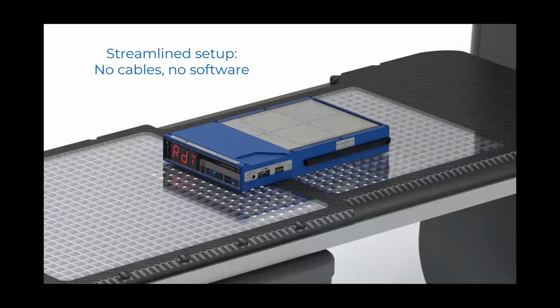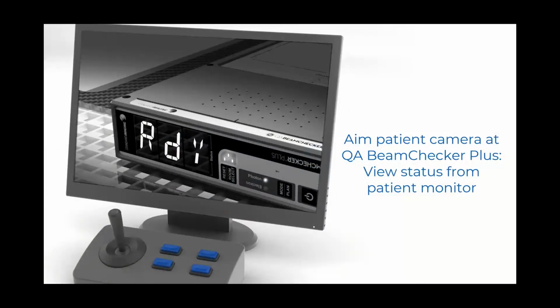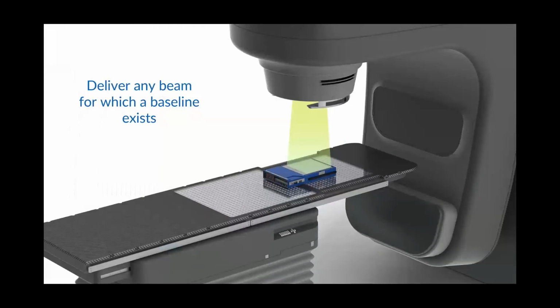But once you have it set up, you line it up. You can aim the patient camera at the large display there. You see that it's RDY, stating that the unit is ready, and you can view the status on that patient monitor as you go through your checks too. So then you deliver your beam, and you'll notice on the readout here, you'll see those 3 diagonal lines. Those will spin, giving it a rotational motion when it's receiving radiation. So you know through that monitor if the unit is receiving the beam correctly. So you deliver any beam for which a baseline exists.